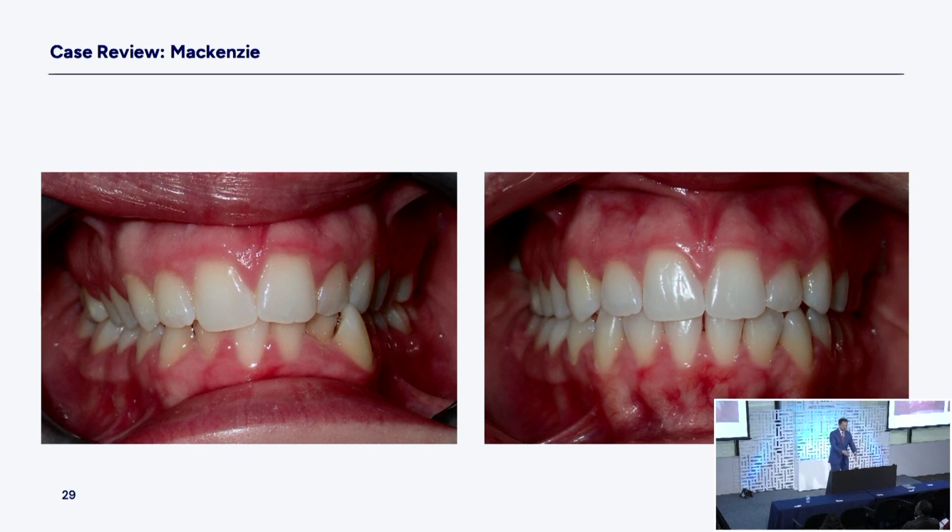So it's changing beautifully. You could see the little whitening gel lighten the color, but the back teeth fully upright. Upright and vertical, very nice. But here, even in this picture, you can see the wisdom tooth sticking into the side. Both sides, there's a hint of it. We want those wisdom teeth.